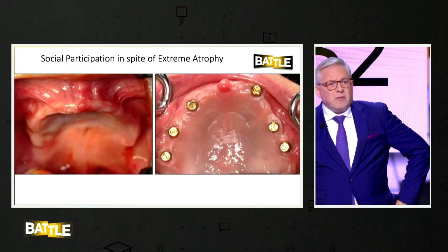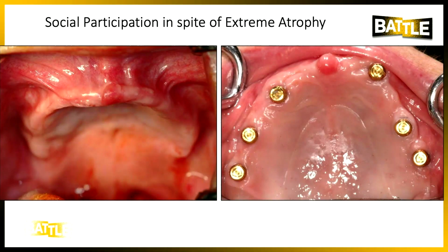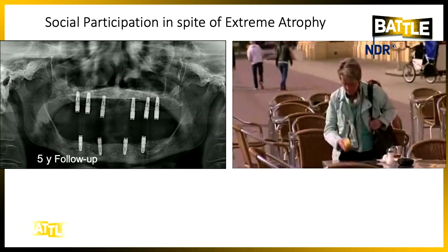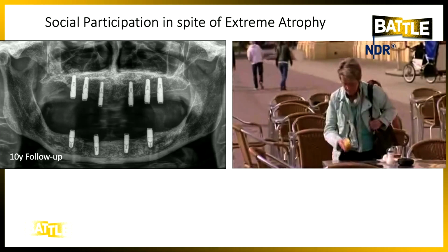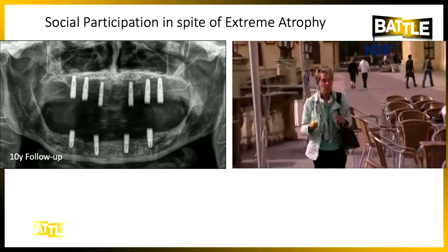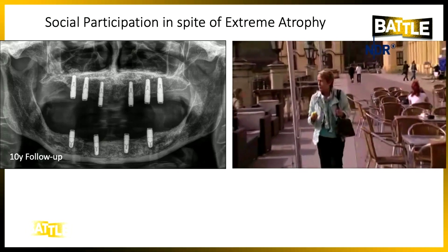The fixed gingival tissues have reappeared without any soft tissue grafting, just bone grafting, and also in the mandible you can see the difference. The crest emerged again, and food strips off, and this becomes self-cleaning. The 5 and 10-year follow-up shows that it is a sustainable rehabilitation. And although this patient is over 70 years old, she can bite an apple and is self-confident to visit a public restaurant.